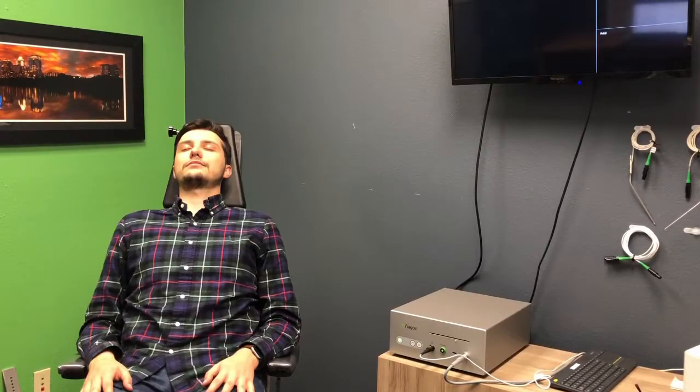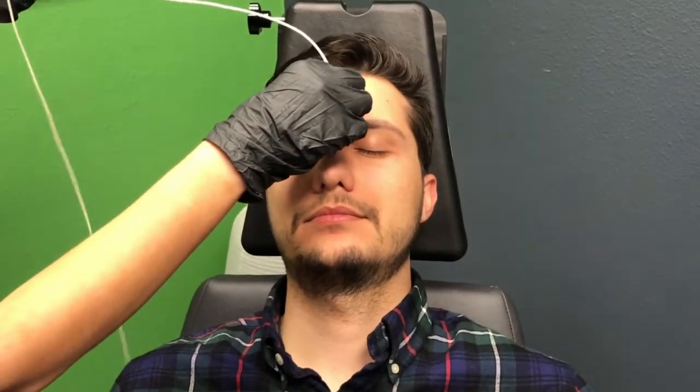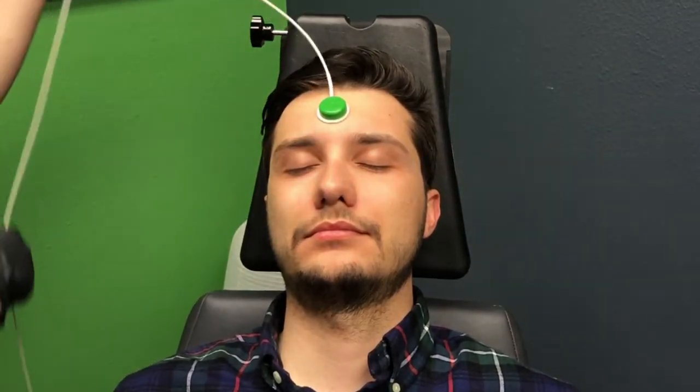The patient should be positioned so that the patient's head is centered against the headrest throughout the procedure. It is recommended to use an alcohol prep pad to first wipe the area where the localizer is to be placed in order to ensure a secure adhesion to the patient's skin. Once the patient is in place, attach the patient localizer and corresponding adhesive pad to a stable location on the patient's forehead where the localizer will remain center of the field generator.